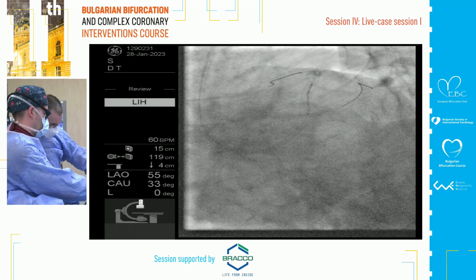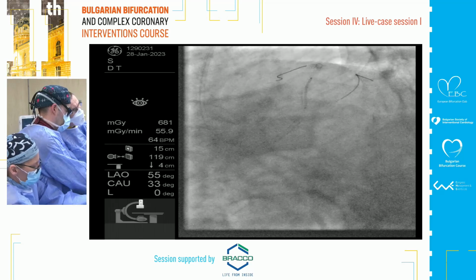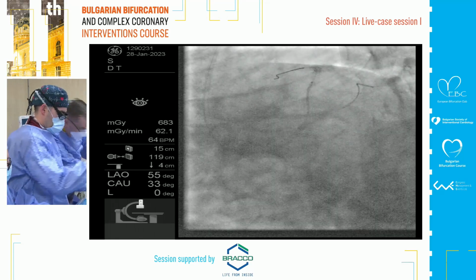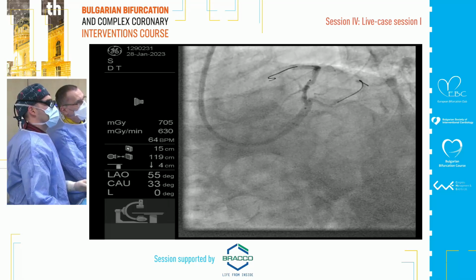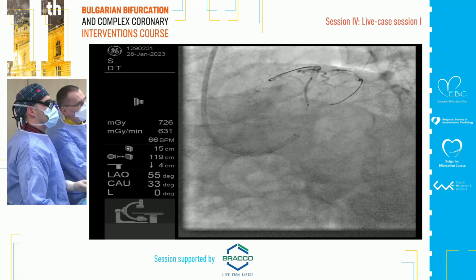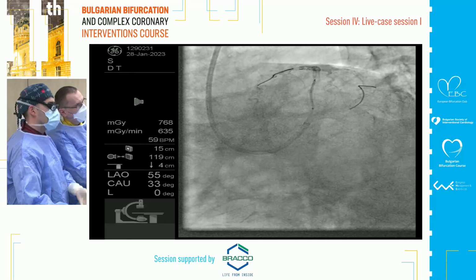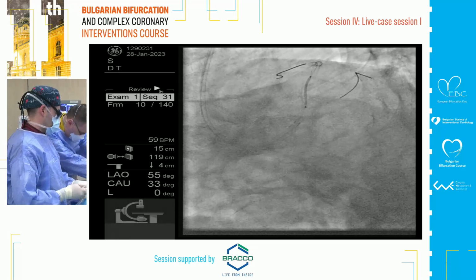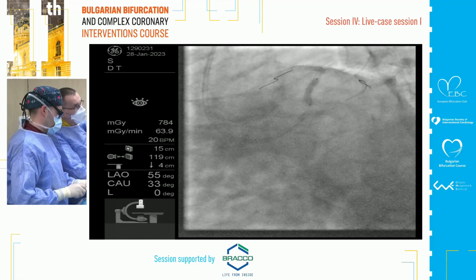So, if you would have done crossover into left main, probably yes. Robert will nail this ostium, because sometimes the IVUS images, sometimes we can make an exception when the angle is really 90 degrees. Yeah, then it's okay. This is a very acute angle.